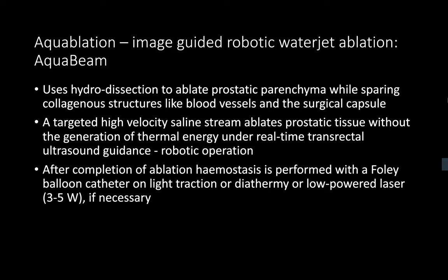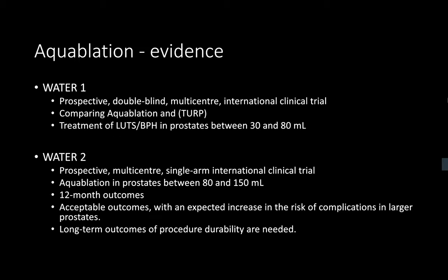We will start by doing transrectal ultrasound to have anatomic mapping for the prostate. It allows us to show the whole length of the prostate, starting from the bladder neck down to the verumontanum. And then we will introduce the urethral handpiece, check the anatomy of the area, and check that the bladder is fine, there is nothing significant in the bladder.